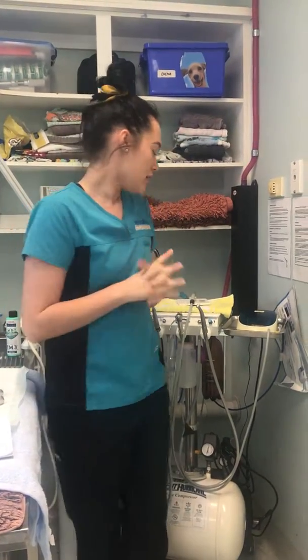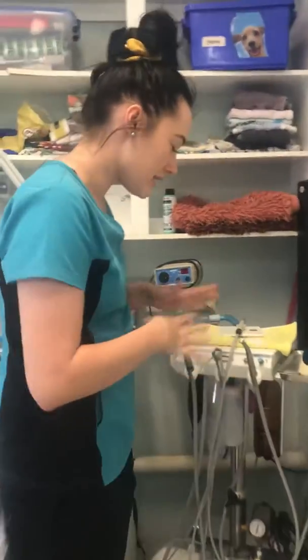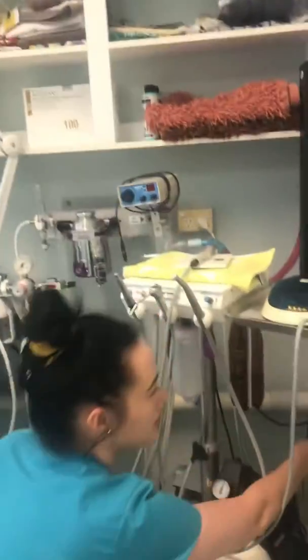Hi, my name is Lanisha Yelden, and today I'll be showing you how I set up dental for a dental procedure on a canine with simple extractions. So first, you've got your dental machine all set up. It's already all plugged in at the wall.